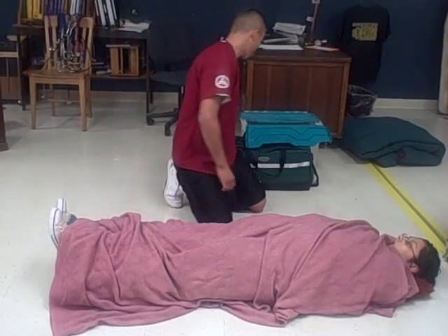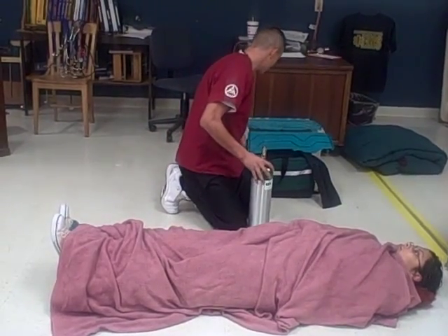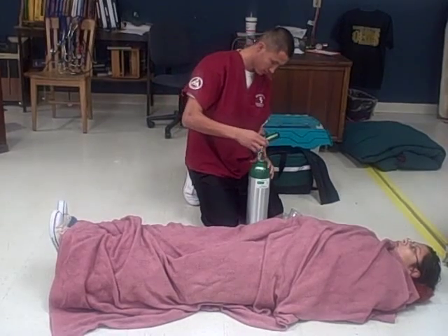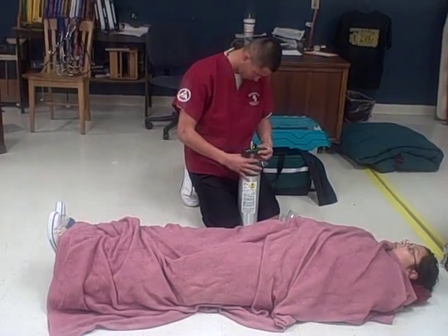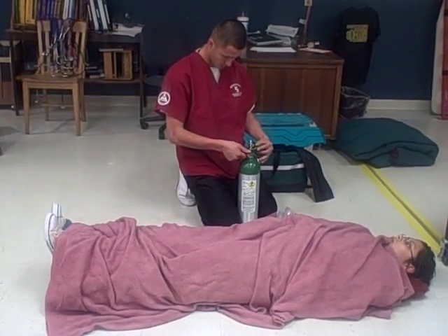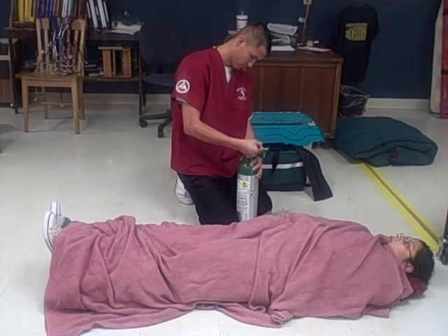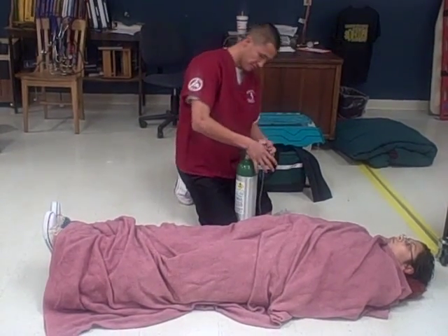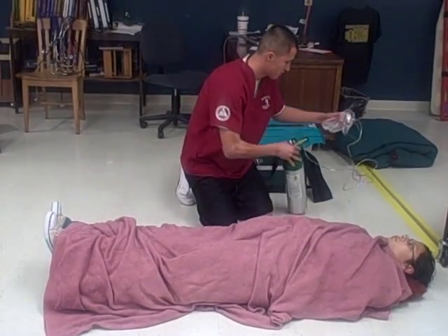And now I will apply oxygen. I will do a little bit of a hand bag to check for leaks, and if there were no leaks in there, I will continue bagging the patient.